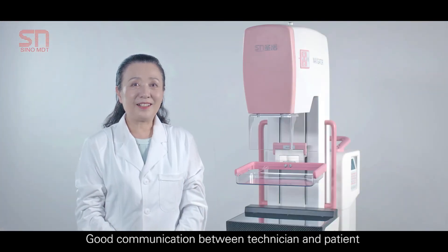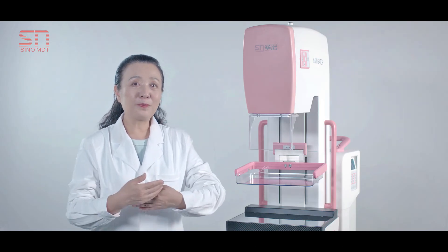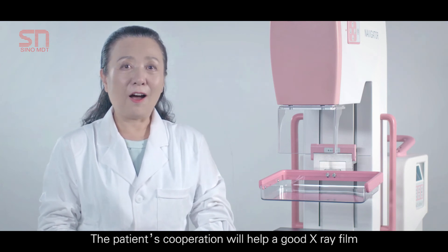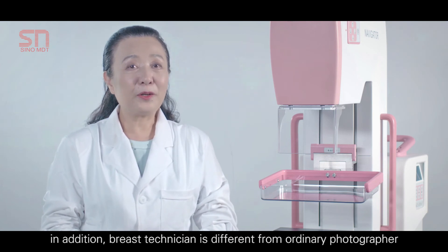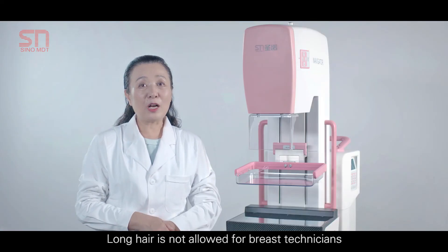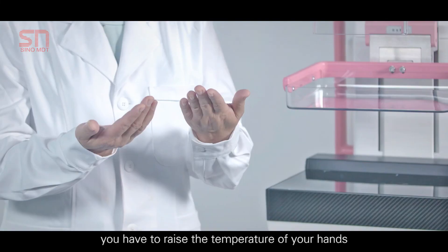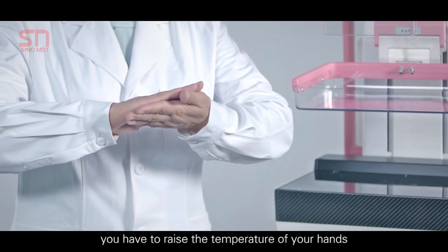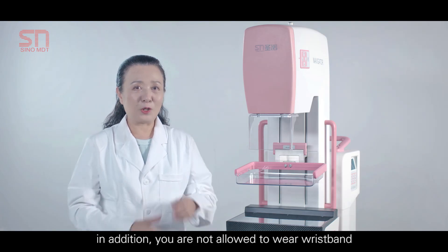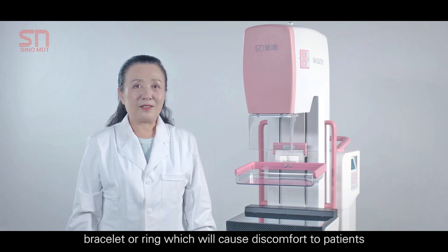Good communication between the technician and patient is required for mammography. The patient's cooperation will help produce a good X-ray film. Breast technicians differ from ordinary photographers — long hair is not allowed, and in cold winters you must raise the temperature of your hands. We also need to notice the length of our fingernails, and we are not allowed to wear a wrist band, bracelet, or ring, as these will cause discomfort to patients.